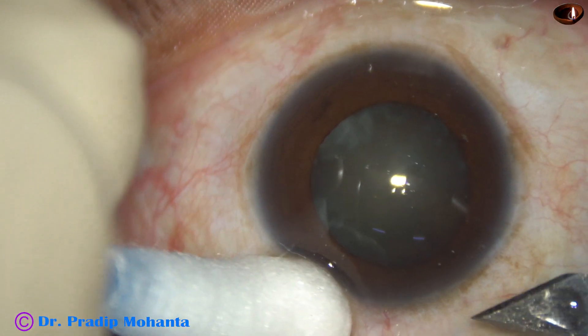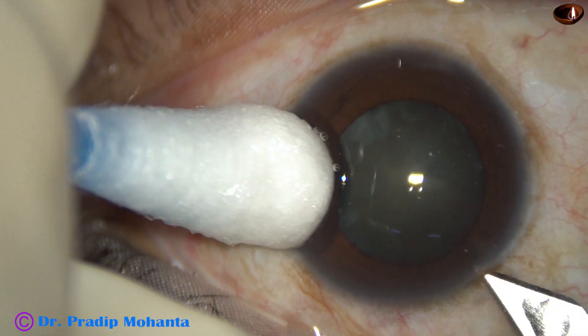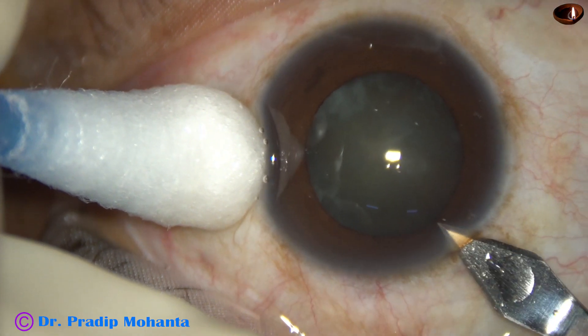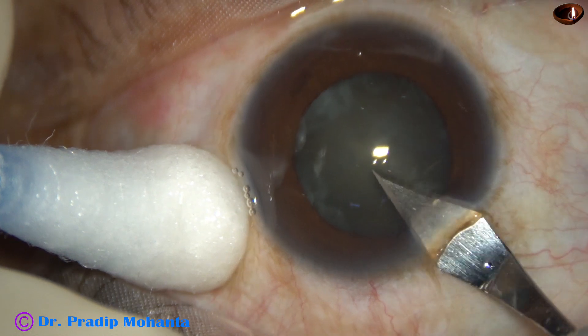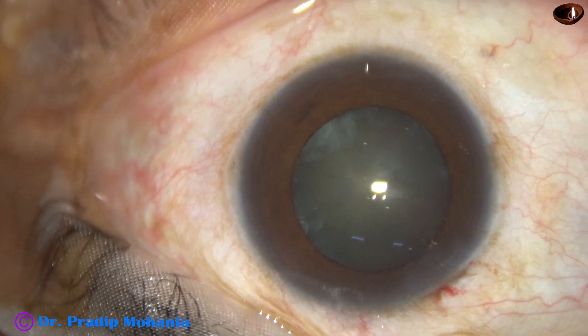The ocular surface has been thoroughly cleaned and thoroughly irrigated with povidone iodine and BSS balanced salt solution. This is the main incision — a triplanar incision 2.8 millimeters in size at the posterior aspect of the limbus.